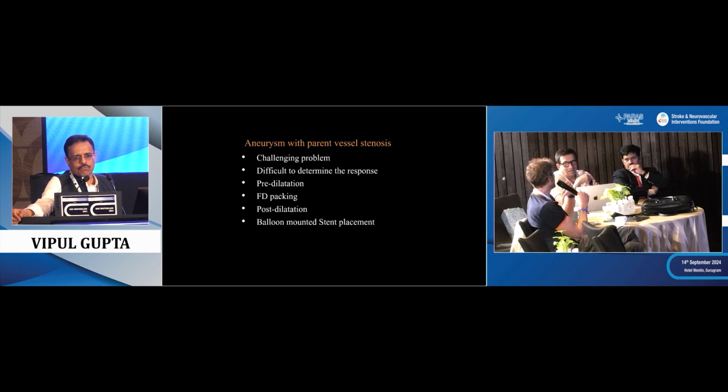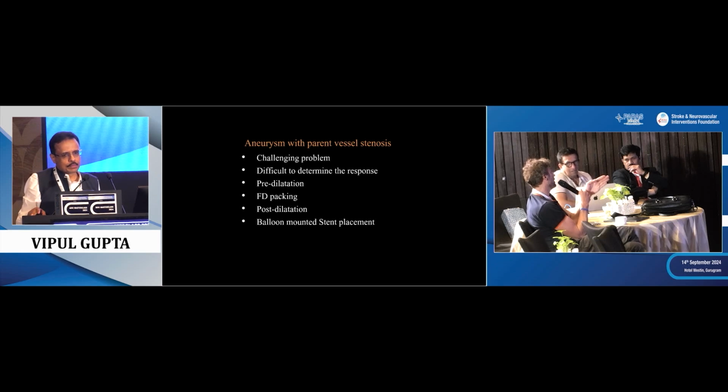Yes, because it's like silk going into a flow diverter. So even if it was a little bit challenging, you can go with the intermediate catheter at the mouth of it, and you can always place a coronary stent. I think this is a better way of going, because putting a coronary stent and then going through it is not easy. To me also, you increase the difficulty.